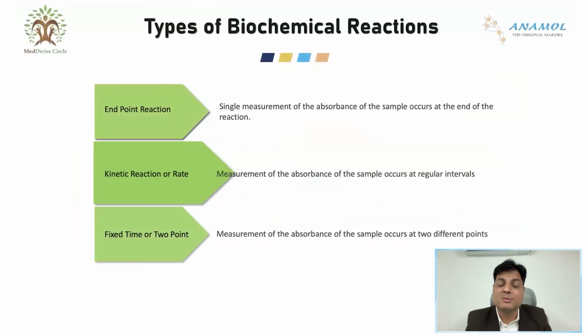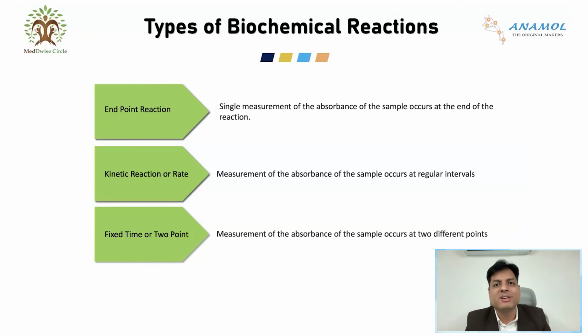Friends, this is the difference between kinetic reaction and fixed time kinetic reaction.